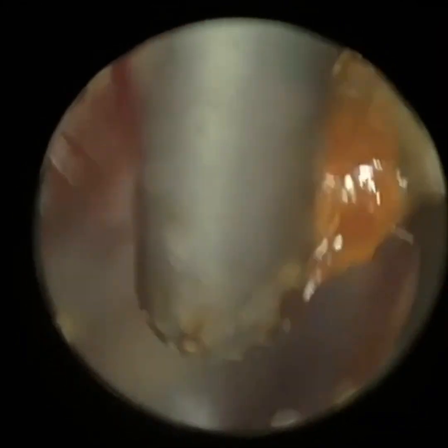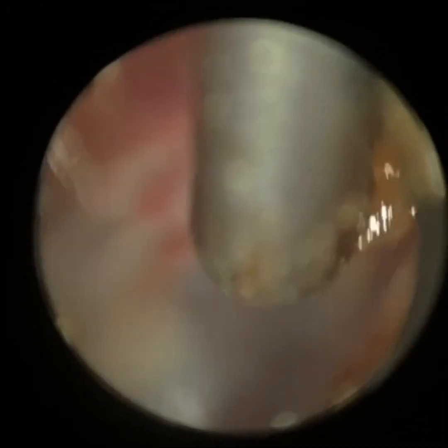If you were doing this with loops, your neck would be twisted upwards looking at the top of the ear canal. But with the Waxscope and the iClearScope endoscope, you're just looking at a monitor right in front of you — the smartphone. So it's much more ergonomic and provides much better body posture. There's just a bit of skin to the anterior canal that the Waxscope is going to peel away.